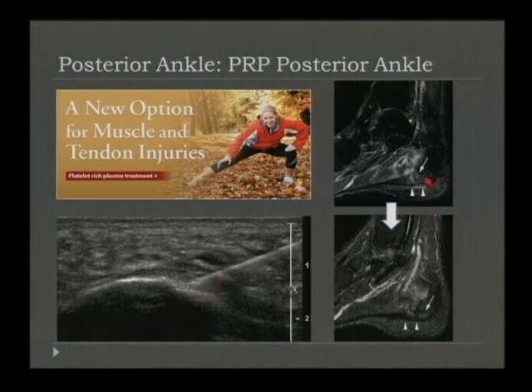This is a patient that originally had 2 years of pain, continued to run, however, unfortunately, and ended up tearing. You can see on this fluid sensitive sequence, this bright area here is a tear in the plantar fascia. There is some of the fascia remaining. You can see a lot of high signal here on the undersurface of the fascia with inflammatory changes there, and they even had high signal in the adjacent calcaneus consistent with some bone marrow edema.